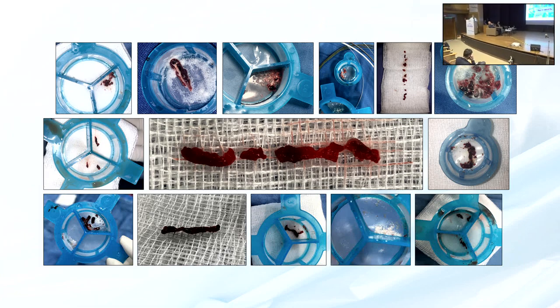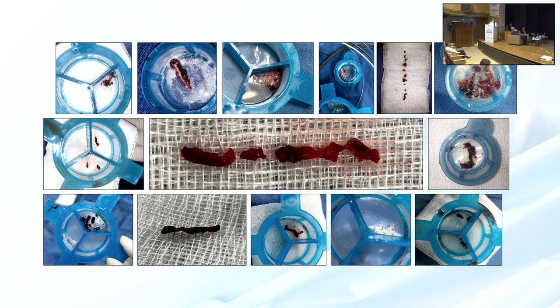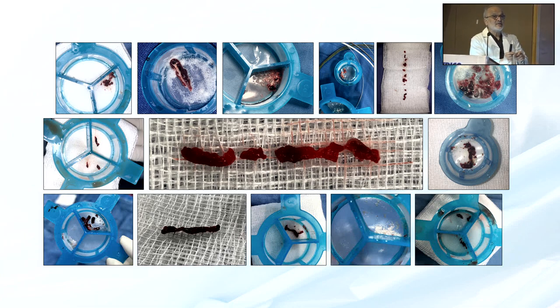You can use maybe a 12 or 15 millimeter balloon. Depending on the angle and the tortuosity you see proximally, you decide what pressure you want. If you have to skip a couple of tortuosities, put a very low pressure, about 2-3, so the balloon is also very flexible. If it is a very straight segment, you can go up to 5 or 6 atmospheres, so the balloon is a little straighter. And if you want good trackability without any disturbance with the balloon assistance, you can keep a very little, 2 or 3 millimeters, out. Otherwise, you can keep a proper length of balloon outside.